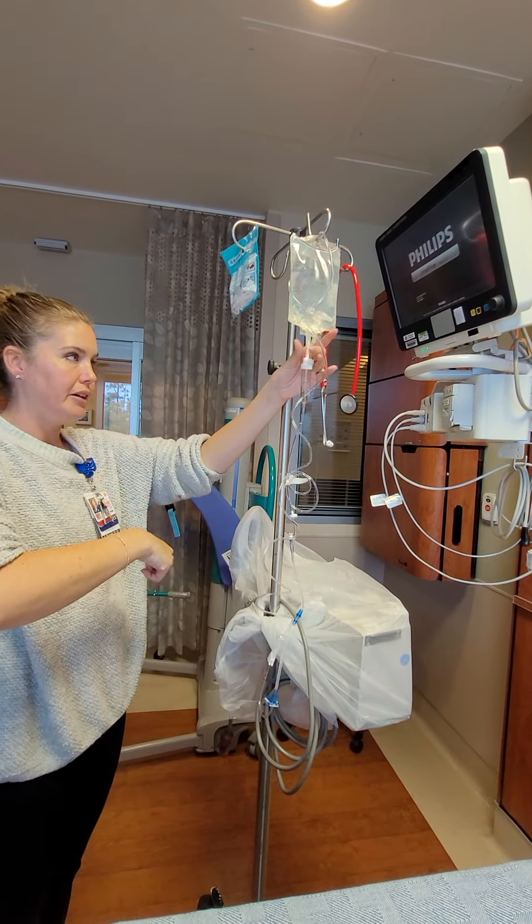You're going to have mom or dad help you position the patient. Just depending on the age, prep them for what's going to happen. We've had anywhere from a 10-year-old to a 10-month-old have this done, and I'm sure there are outliers as well.